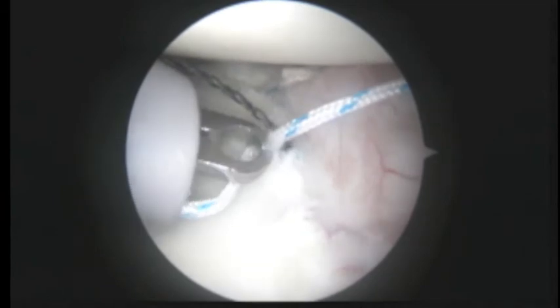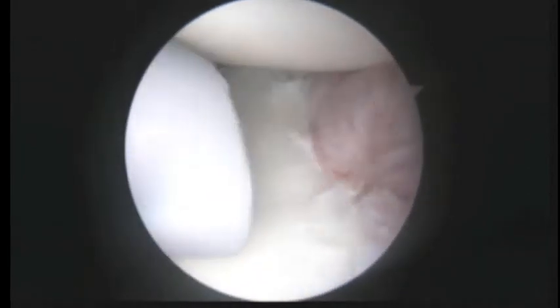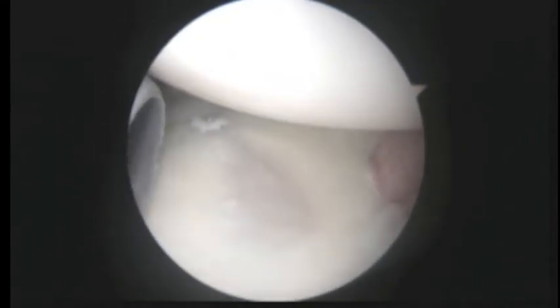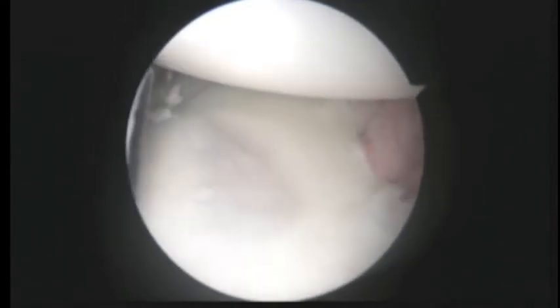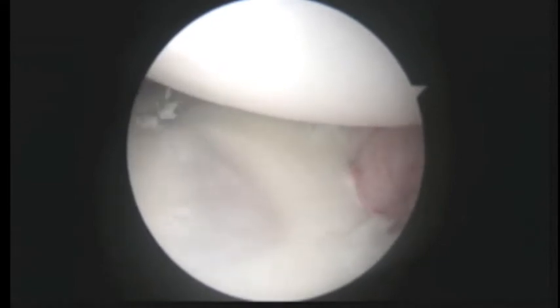So we'll go off on the video for a minute. Pause, please. So there's the front of the shoulder. That looks pretty good. We've got three suture anchors in, and we've really, really tried to reconstruct that anterior wall and tighten up the ligaments. We're gonna put the shaver in the back here, clean up a little bit, and then we're gonna put the camera in the back and fix that biceps anchor.